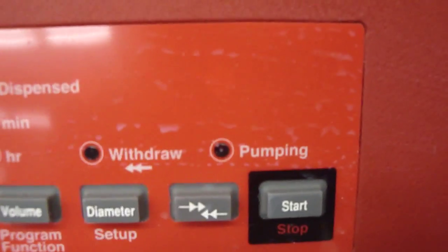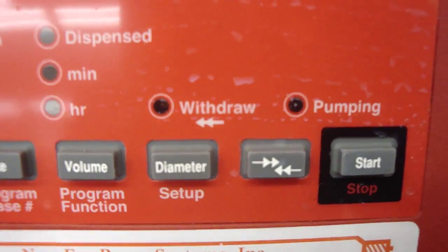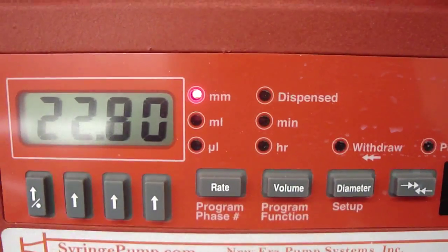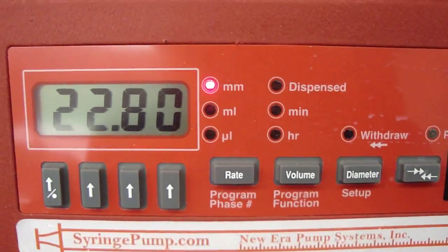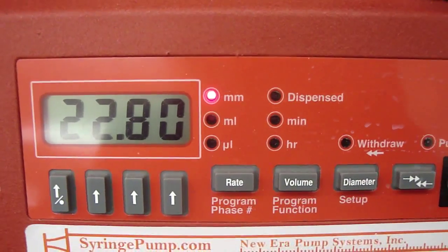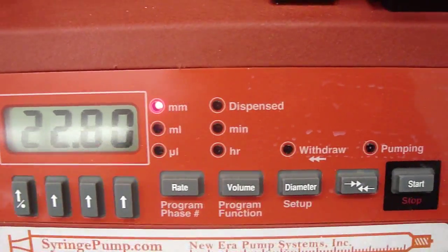And the third function that you can use here is the diameter. Remember, do not change the diameter. It's 22.8 millimeter. Do not change it.